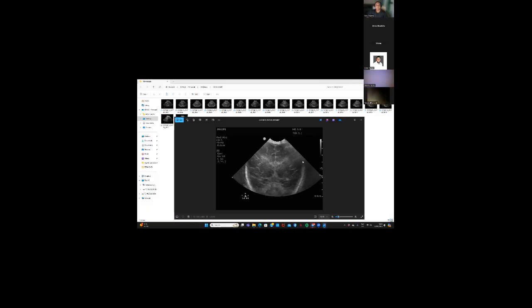I don't know if it is because I could not see a lot of the gyri and sulci, or if there is cerebral edema. That is the thing I am slightly concerned about. Even your ventricles at the moment are very small, very slit-like, and the gray white matter differentiation that you should normally see, I just worry about that.